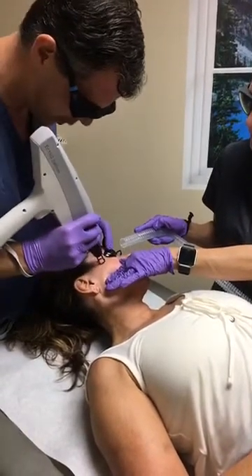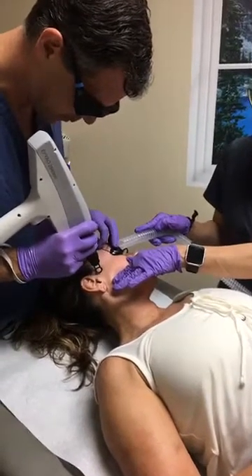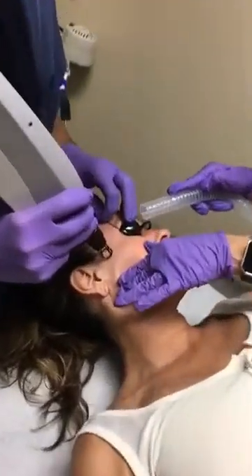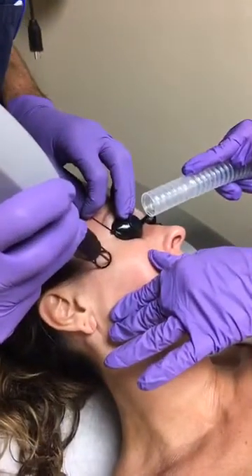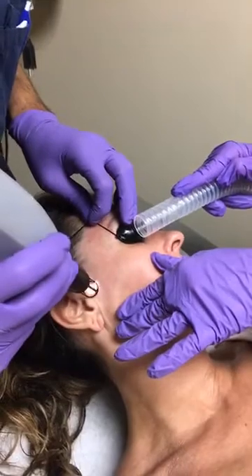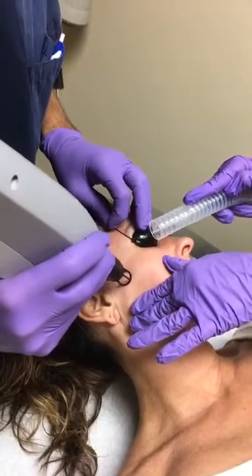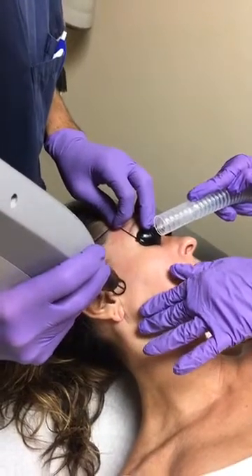We are going to augment what we do with the Botox. It is a perfect treatment to consider here.